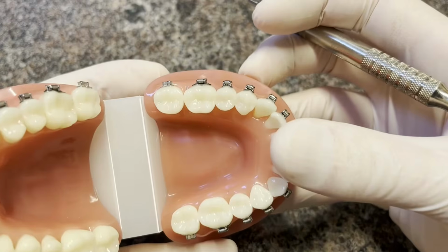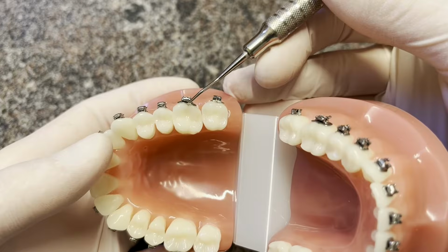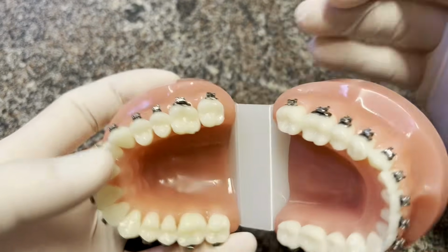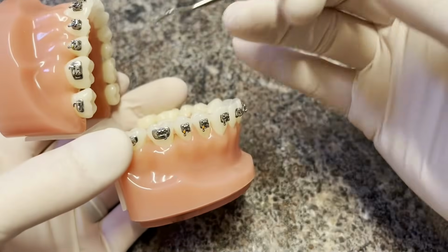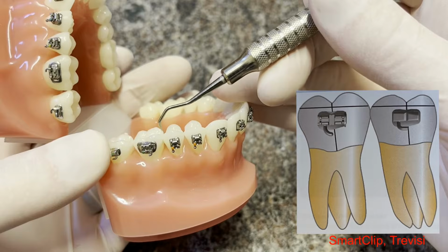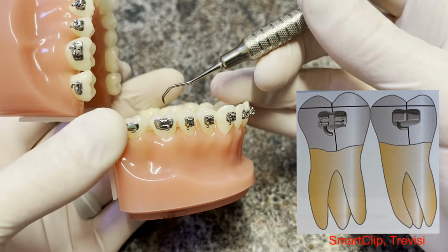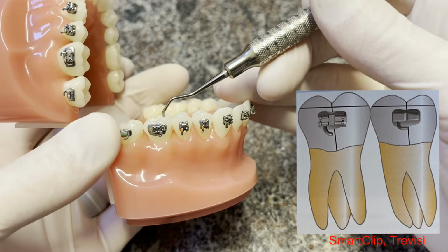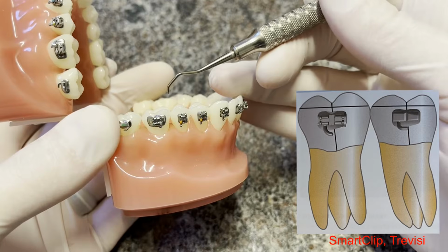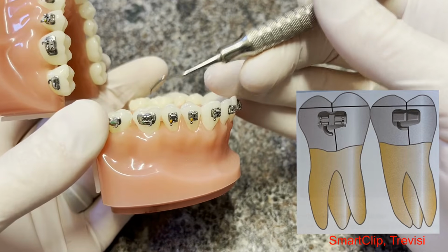So the 6 on upper and lower, you'll see it has a groove right here. There's a groove in these American Orthodontics brackets that sits right in there, and then you want the top of the base of the bracket to be parallel to an imaginary line that connects the mesial and distal marginal ridges right here. So this is pretty good bracket placement on this dentiform. This is not totally parallel. I would raise the mesial up just a hair, but you get the idea. And about 1 millimeter from the edge-ish, roughly.